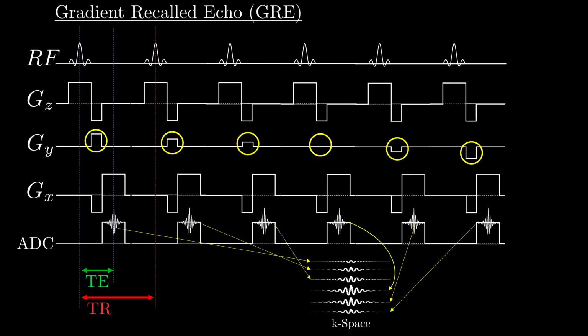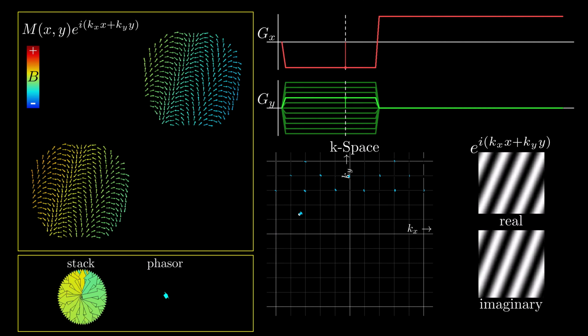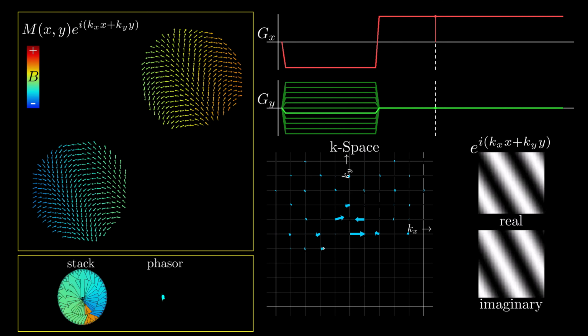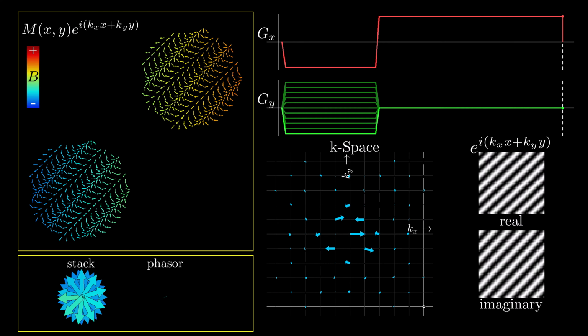And now let's get back to our animation slide and play the gradient echo. I'm only showing each TR's encoding steps here, understanding that the same slice selection is being performed for each TR. Isn't this fun? So we see that the gradient echo is essentially just a raster scan of k-space, one line acquired for each TR. Thus, if we need n phase encodes to fill k-space, then the time to acquire one image slice will be n times TR. Note that the frequency encode gradient time, or readout length, does not affect the scan time.